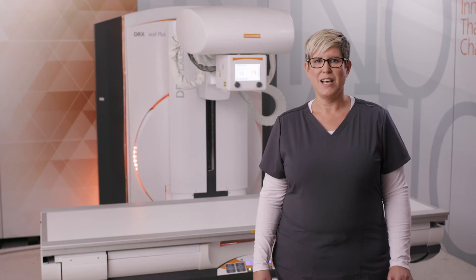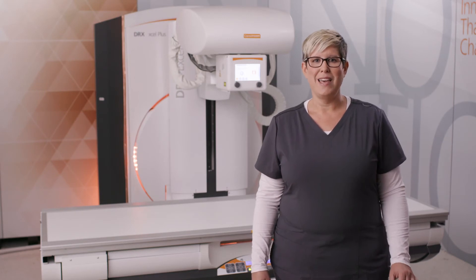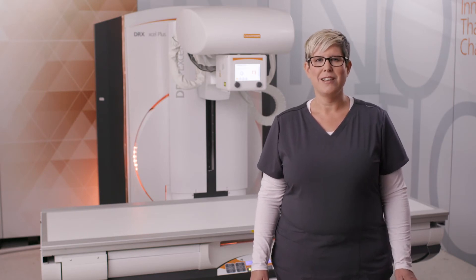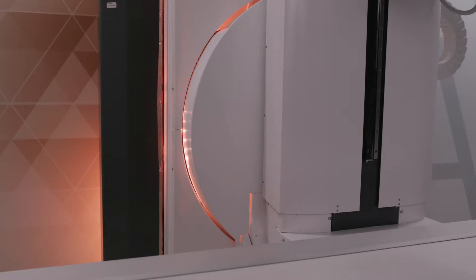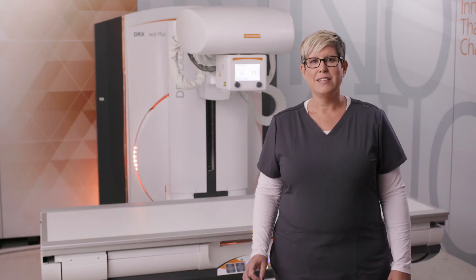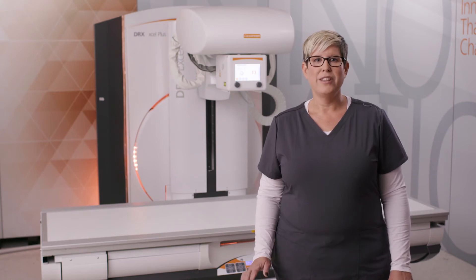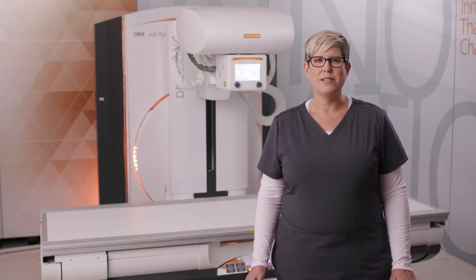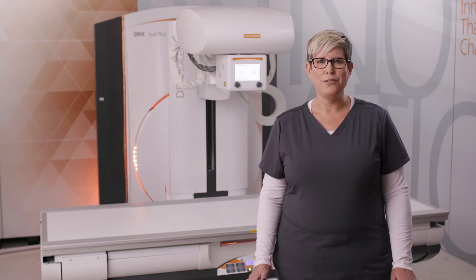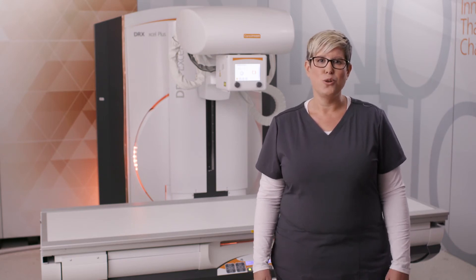The DRX XL Plus was designed to make the examination experience as calm and comfortable as possible. Ambient lighting and music help put the patient at ease throughout the duration of their procedure. Additionally, the table can be operated with an optional hands-free positioning pedal, giving physicians the ability to maintain a sterile field while still having control of the equipment.